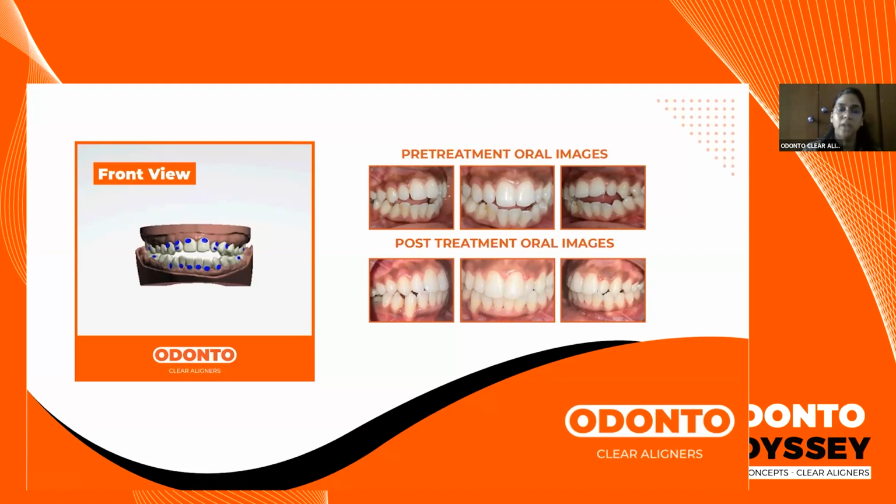That is one part. If it is a skeletal open bite, and also a dental component is present, then you can always go in for correction of the dental component with your aligners and then progress to a hybrid approach wherein mini implants will be required. You can incorporate those, or you can have a hybrid approach wherein conventional braces are used at a later date, because there is a limitation as to how much the aligners can correct.